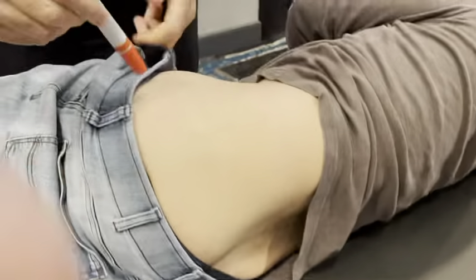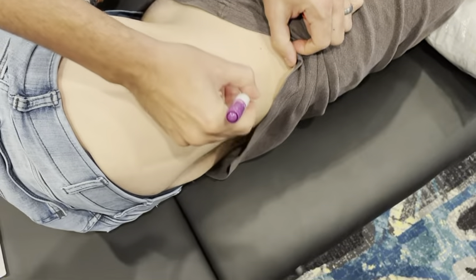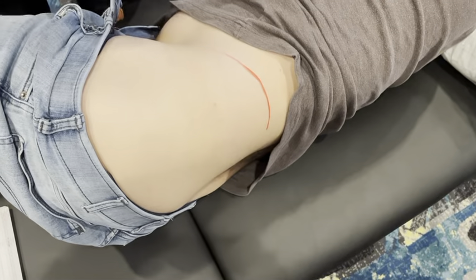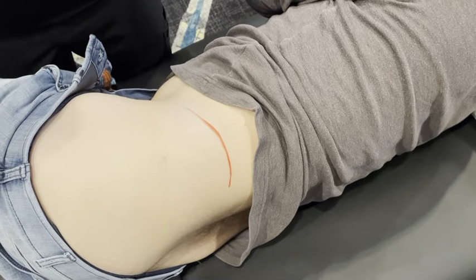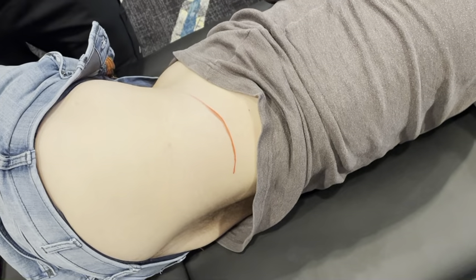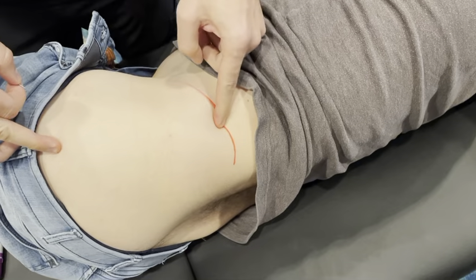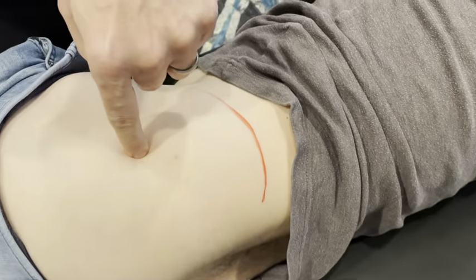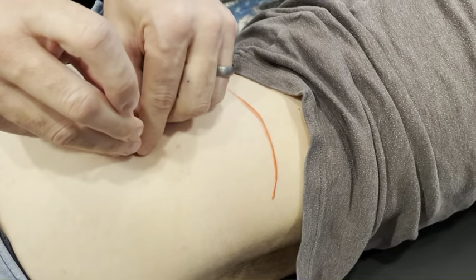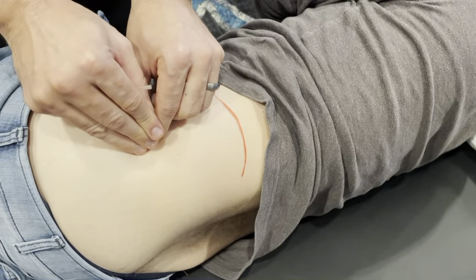So we find the greater trochanter — here's the top of the iliac crest. We bisect it and you'll see a depression right there. Going in right there, if I go deep to this I'll hit the neck of the femur, going right through the capsule.